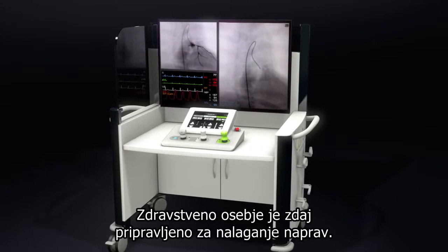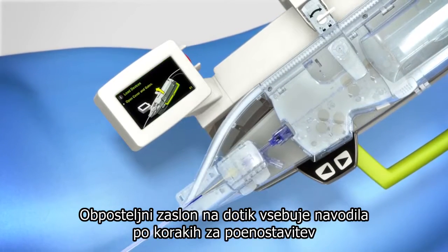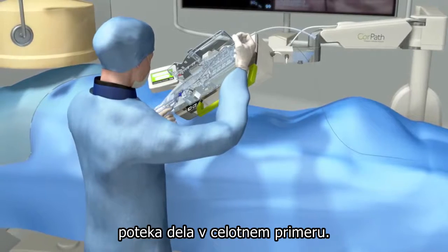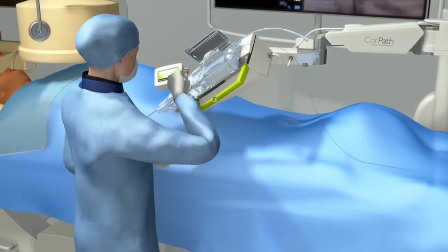The Scrubs staff is now ready to load the devices. The bedside touch screen provides step-by-step instructions to streamline workflow throughout the case. Once the devices are quickly loaded into the cassette, the intervention is ready to begin.